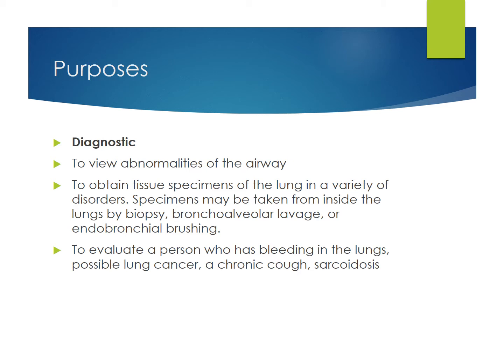Purposes: diagnostic, to view abnormalities of the airway, to obtain tissue specimens of the lung in a variety of disorders, specimens that may be taken from inside the lungs by biopsy, bronchoalveolar lavage, or an endobronchial brushing, to evaluate a person who has bleeding in their lungs, possible lung cancer, chronic cough, or sarcoidosis.